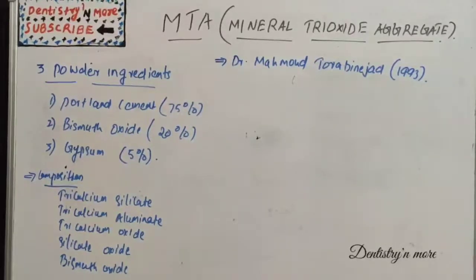As we all know, the quest for new materials is never ending, especially in the field of dental science. Various materials have been formulated, tested and standardized to obtain maximum benefit for good clinical performance. One such material is MTA, which was introduced by Dr. Mahmoud Torabinejad in 1993 in California.